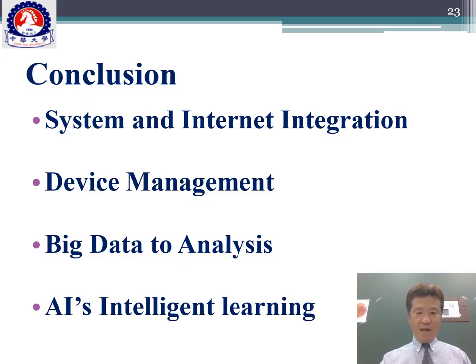Conclusion 1. System and internet integration. The system is only designed for remote monitoring. It receives but is not able to react, respond, or even provide input to the service side. Therefore, medical employees are still needed at the bedside to perform medical art and adjust ventilator parameters.